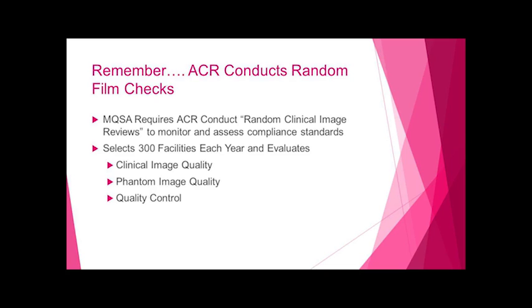I was told there are some additional image reviews that aren't so random, that are initiated by a complaint. They do select 300 facilities each year.